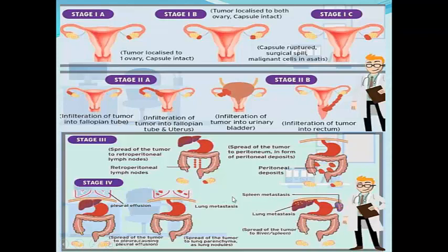This is stage 4. In the staging of the ovarian tumors, PET scan is the best. PET scan is the best in these cases, except for the pitfalls of very small implants, or sometimes in PET scan you see that the peritoneum itself is enhancing on PET CT. It means that there may be tumor cells present in the peritoneum.